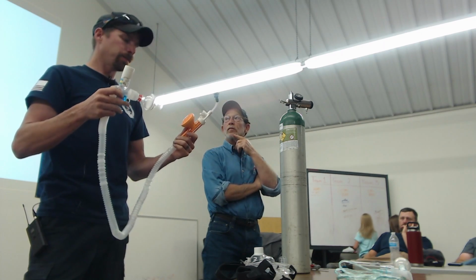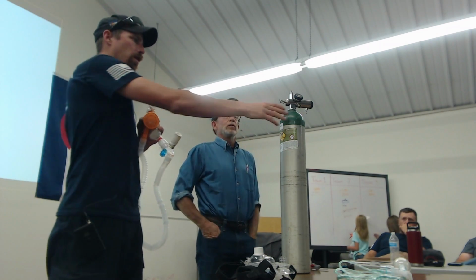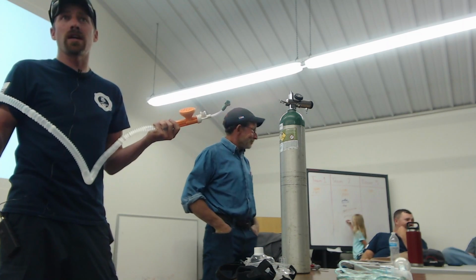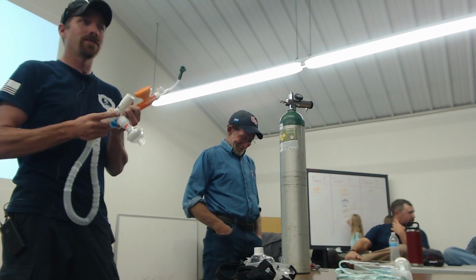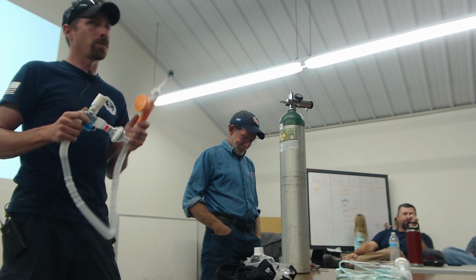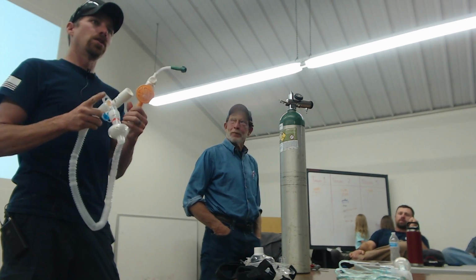One note about both these valves. If you change the FiO2, if you choose to go from a 30 to a 60 or to a 90, and you are on a portable bottle, you better be real close to wherever you're going to get onto some house oxygen. Or if you're even on house oxygen, you better be not too far from the hospital. This thing will burn through even big K bottles real fast, real fast. So if you happen to get on the ambulance that day and there was 1,000 PSI on a K bottle, which definitely can happen any day, right? And we're 20 miles from the hospital, and you're at a 90 on this thing, you're going to be emptied long before you're there. So just know that in your management.